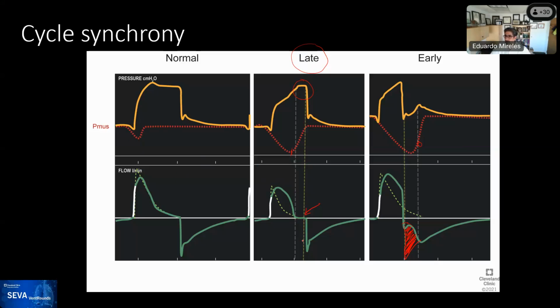Rob? Yeah, like I said in the chat, anytime you have a preset inspiratory time, almost by definition, you're going to have a cycle desynchrony, except by the rare chance. Right? Somebody says it nicely. Yeah. Very good. Good point, Miguel. As always, mastering these concepts.